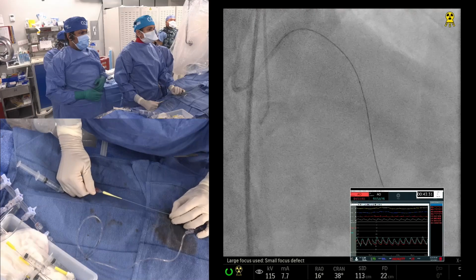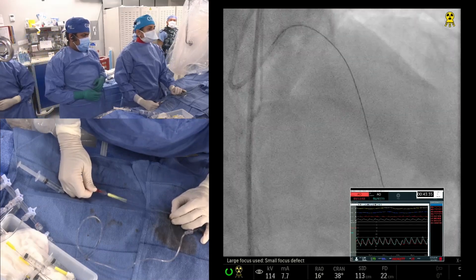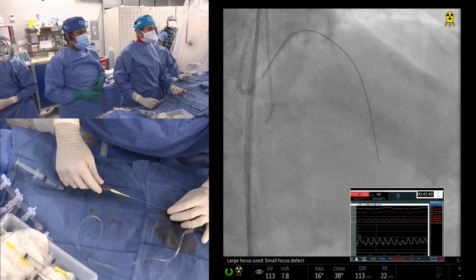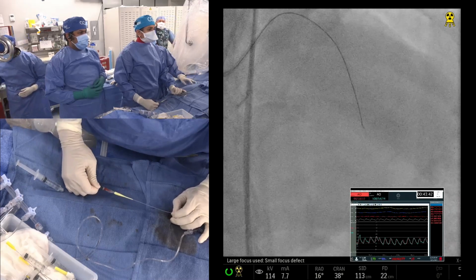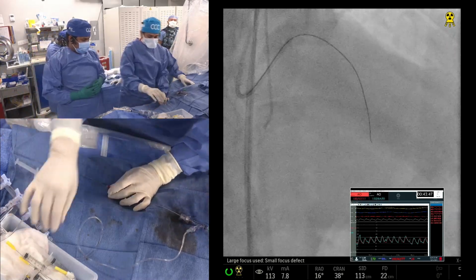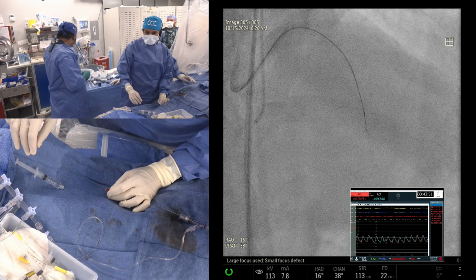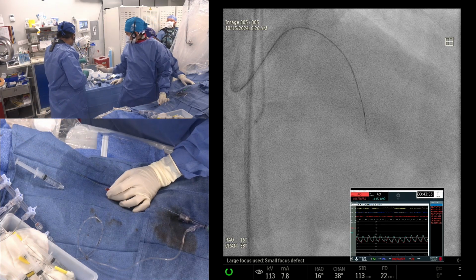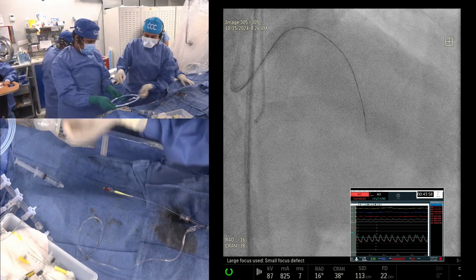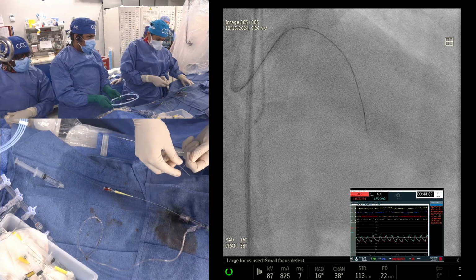So you see how you'll advance. Exchange length. Are you showing my finger movements? Yes, they're showing the hand movement, rotate and advance. And no PVC. That is a good sign that you are in the true lumen and not going epicardial. Okay, 300, run through. And get a 2020 compliant balloon. 2020 first, and then we can get 2.530.